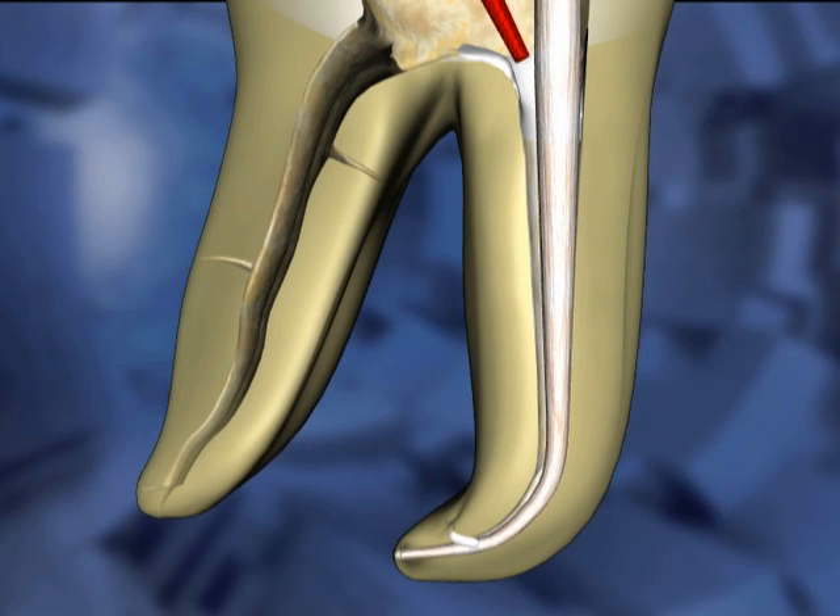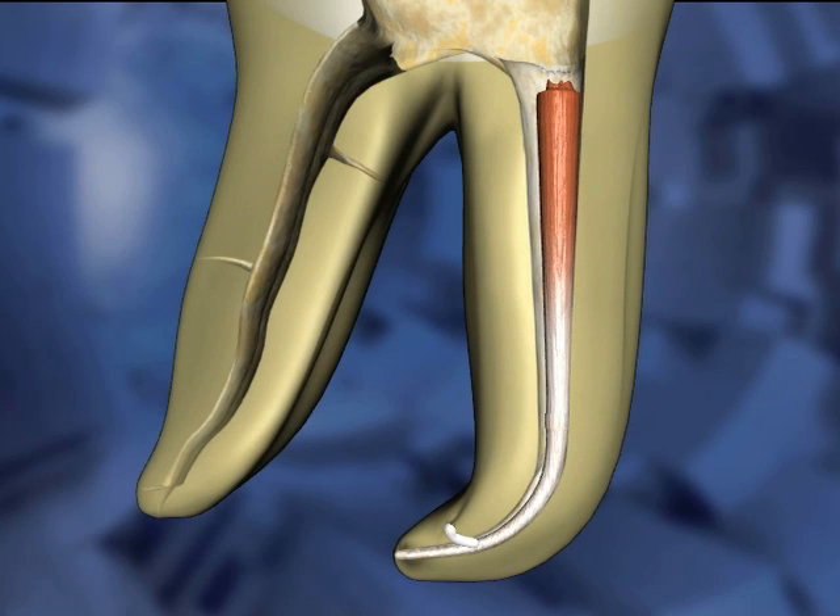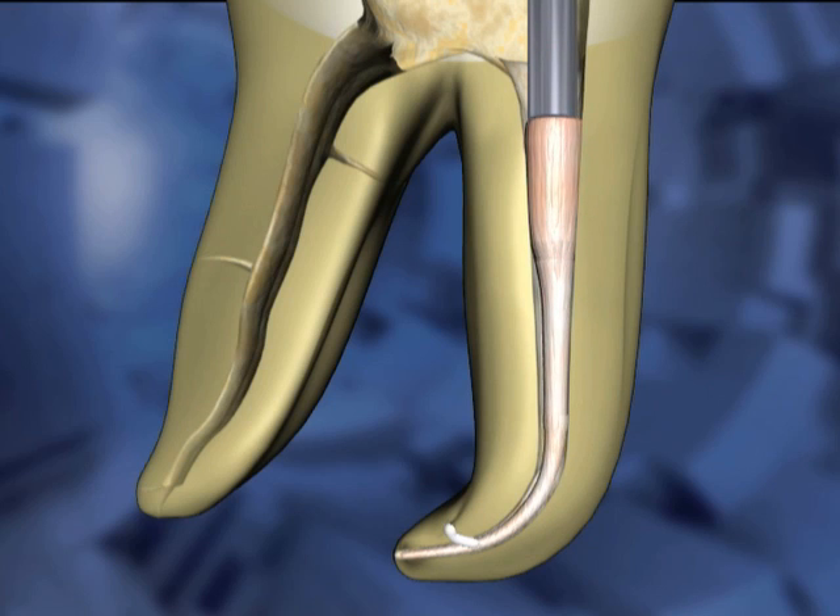A heated instrument is used to remove the excess gutta-percha. Downpacking begins with the largest plugger, which is worked around the orifice. It is then pressed into the gutta-percha mass and held for about 5 seconds, then removed.